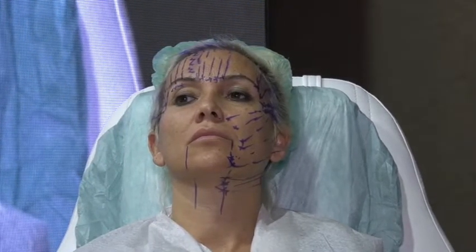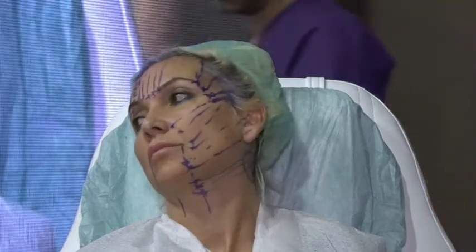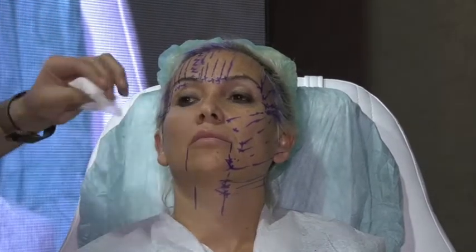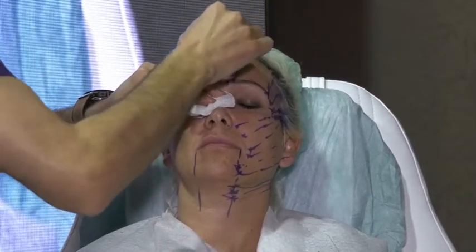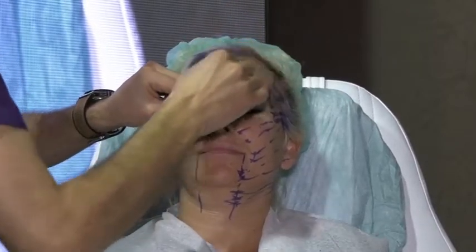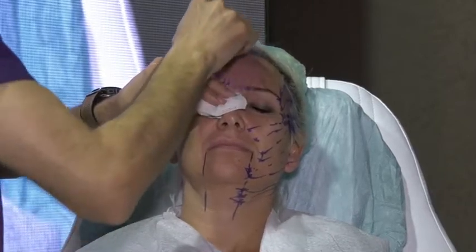Then we start working. But guys, what do you recommend me to do for this model? I want to do for hair. I want to do eyebrow, mid-face, and lower face. I don't like when I say jawline or mind, let us always work with zones. I will do 3 zones for him.